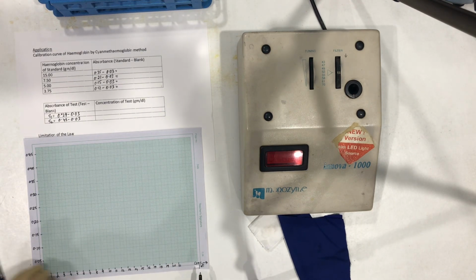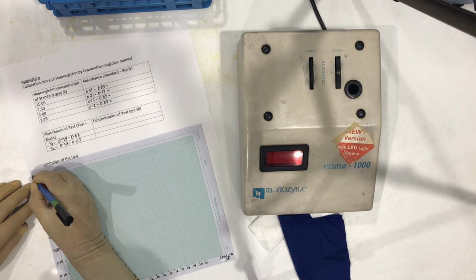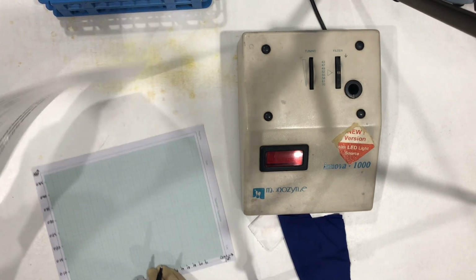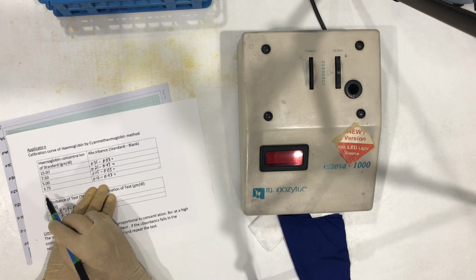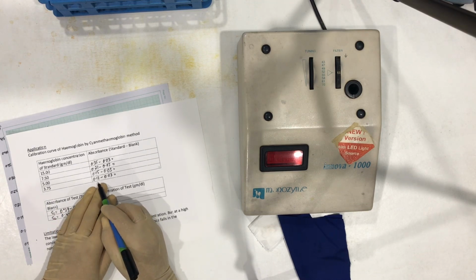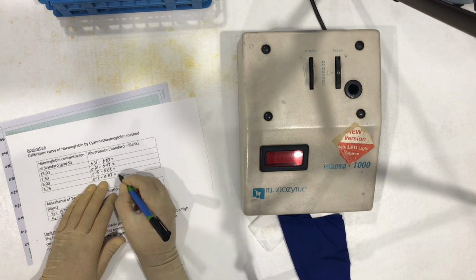This side is our concentration and this side is our absorbance. Now standard 3.75 is giving absorbance of 0.12 minus 0.03 of blank, that is going to be 0.09.